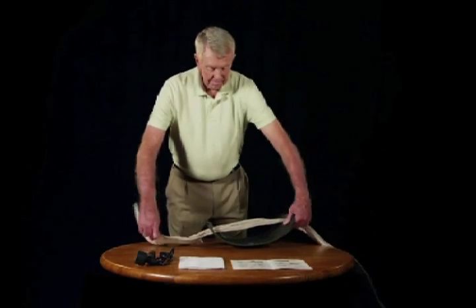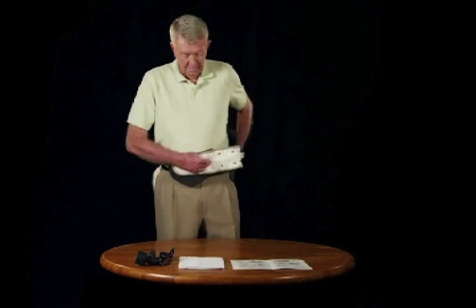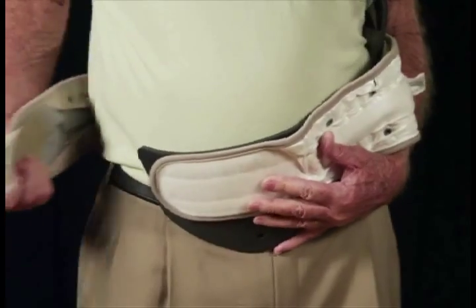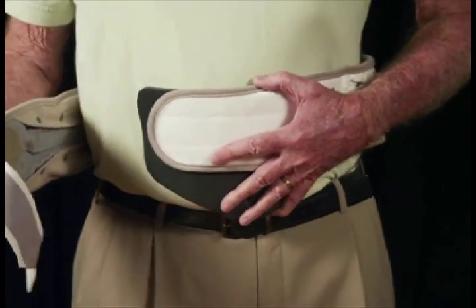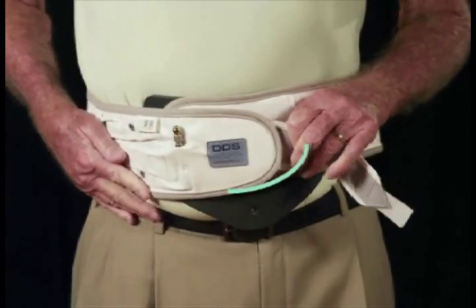Step 2. Wrap the belt around your abdomen, making sure the DDS logo is in the center and upright position. The DDS Belt may be worn on bare skin or over a thin t-shirt. Then attach the primary Velcro enclosure.